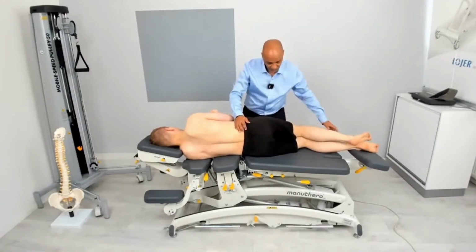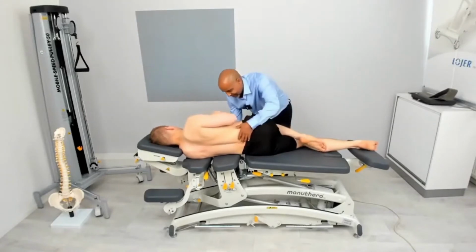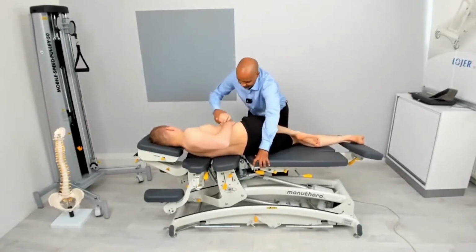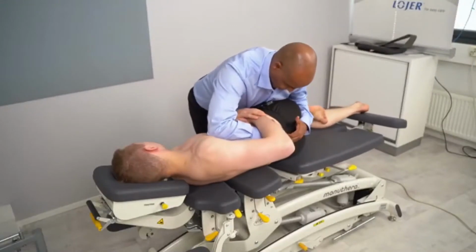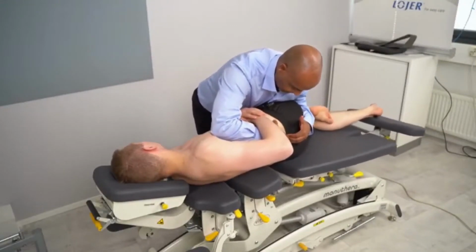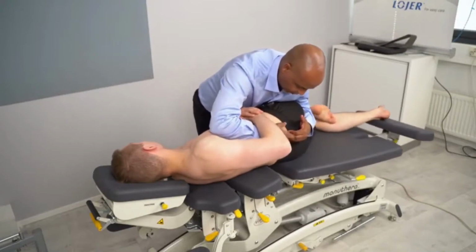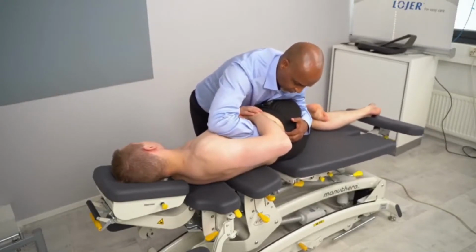I will ask this gentleman to be in this particular position and then activate this. So I will need your hand here, and I need it rotated a little bit. In this case, I can work a little bit on the mobilization of this particular joint to feel the movement, whether it's good enough or not. This is excellent. So I can follow different facet joints to feel how the movements are responding.